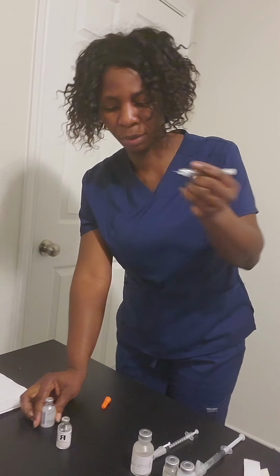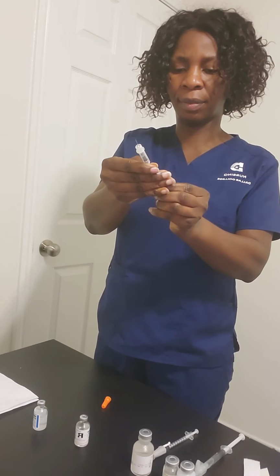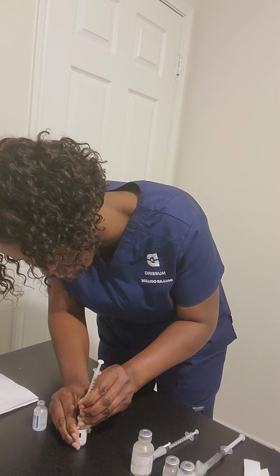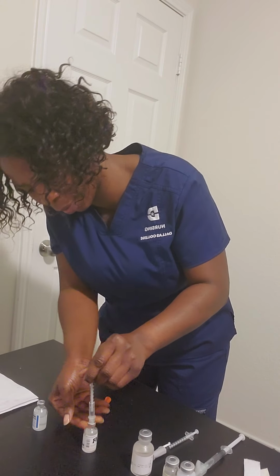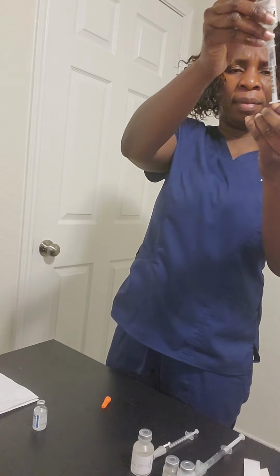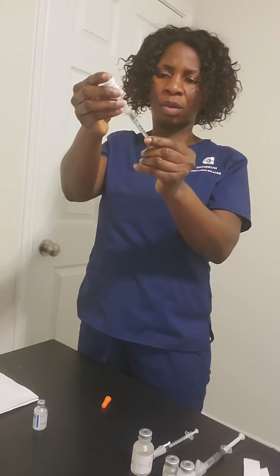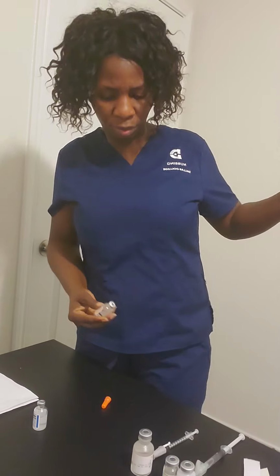I will withdraw the needle. I'll draw another 12 units of air. I'll drop it into the regular, and straight away I'm going to draw 12 units of regular insulin. I've been able to draw 12 units of regular insulin. I'll be showing this to an RN.